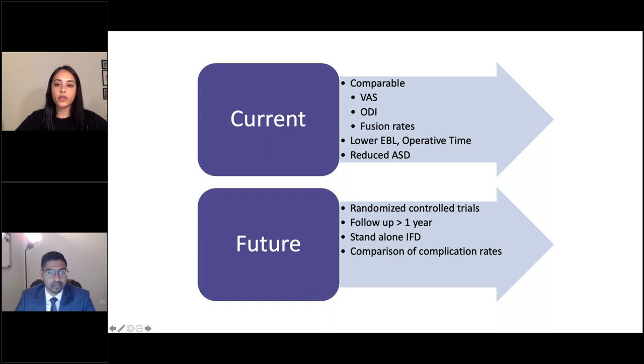Prospective, controlled, randomized trials would be helpful in better understanding the efficacy and role of these devices, as would having longer follow-up periods and more well-defined indications. The majority of studies so far have looked at IFD in combination with other fusion techniques and lumbar decompression techniques, so further research is needed to evaluate interspinous fixation devices as standalone devices. Next slide, please.